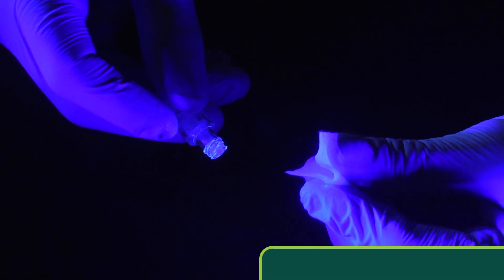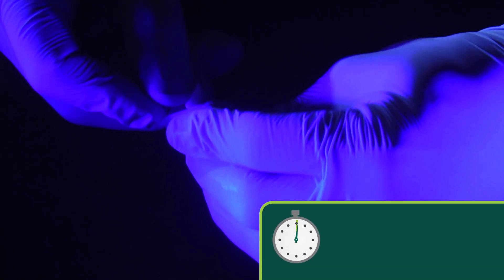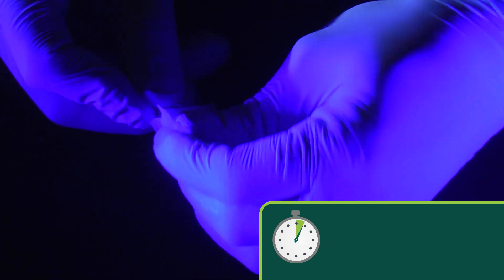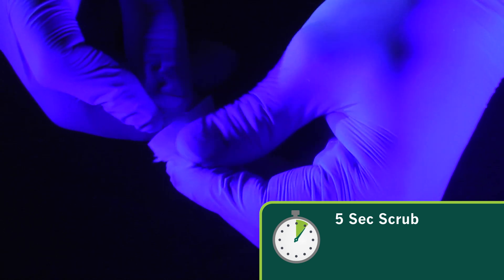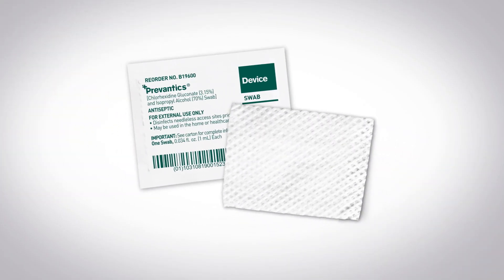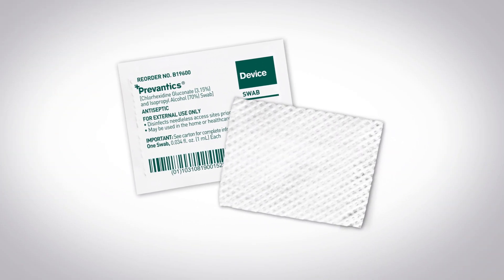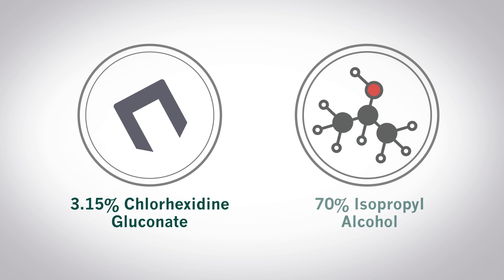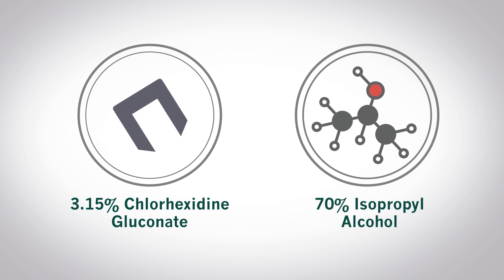Now let's conduct this same simulation using Provantix device swab to scrub the hub. The Provantix device swab only requires a short five-second scrub and five-second dry time to achieve a 99.99% reduction. The unique formulation of the Provantix antiseptic features a combination of two active ingredients that work together: 3.15% chlorhexidine gluconate and 70% isopropyl alcohol.